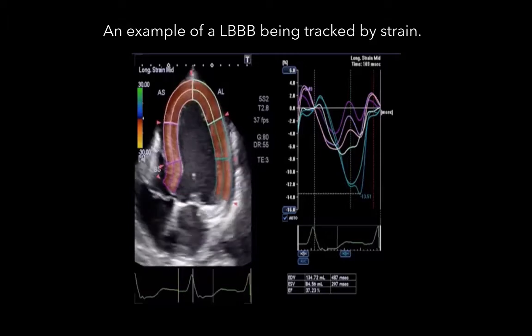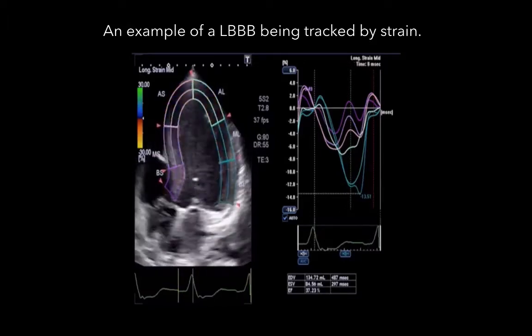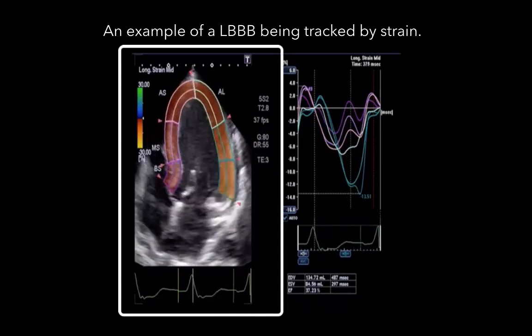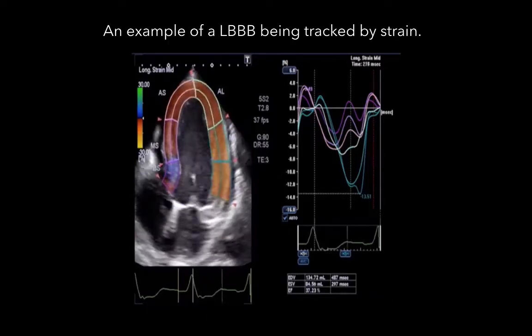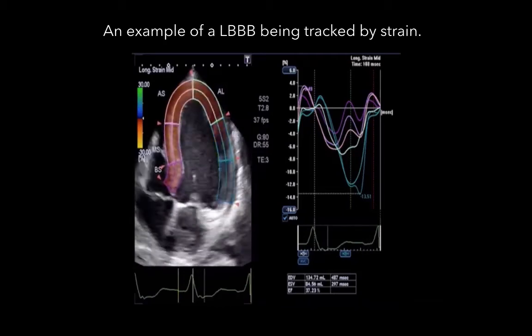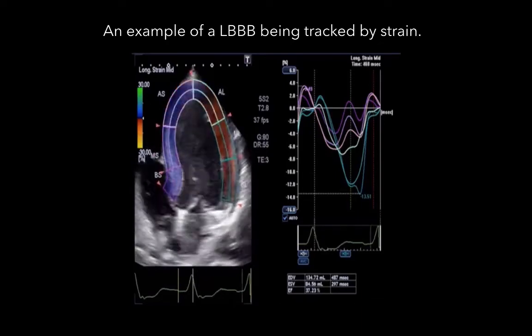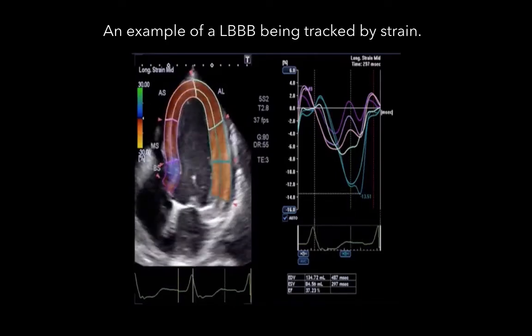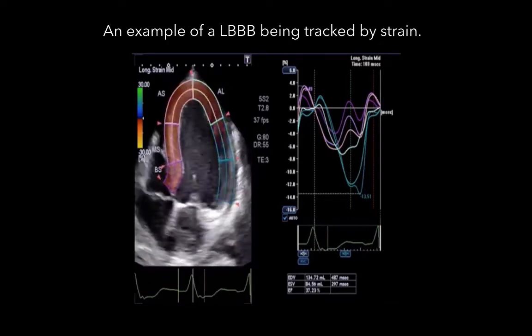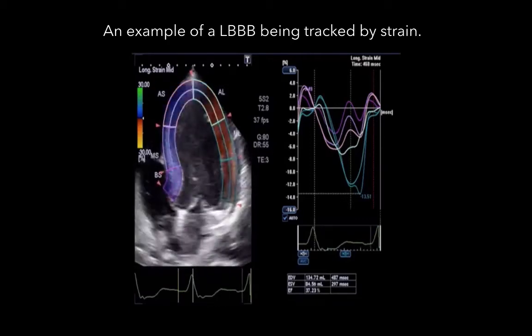This is an example of LBBB tracked by strain to highlight the pattern of contraction. Note how the red — representing contraction — progresses from the septum on the left to the inferolateral wall on the right, representing the LBBB effect on ventricular contraction. In this case, the pattern likely represents solely the bundle branch block rather than true hypokinesis of the septum. The key message is to always refer back to the patient's rhythm and QRS when interpreting echo, using the monitor or EKG leads on the echo machine.